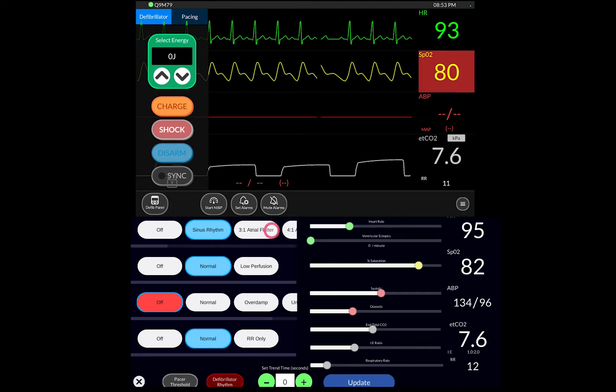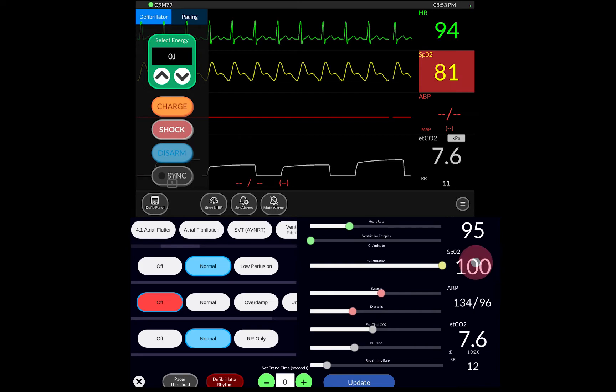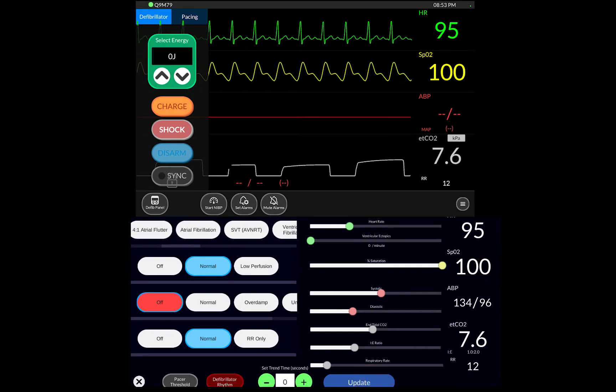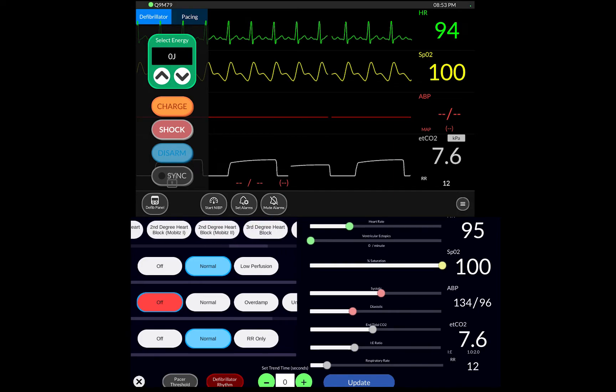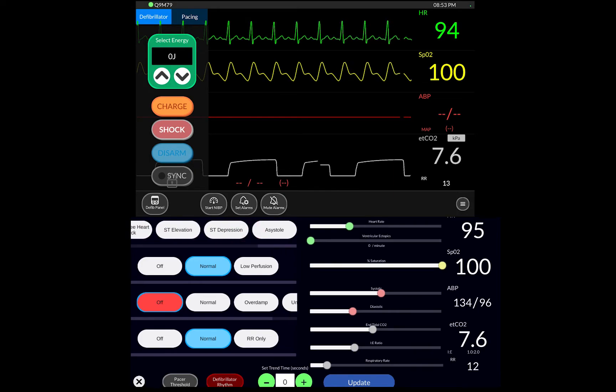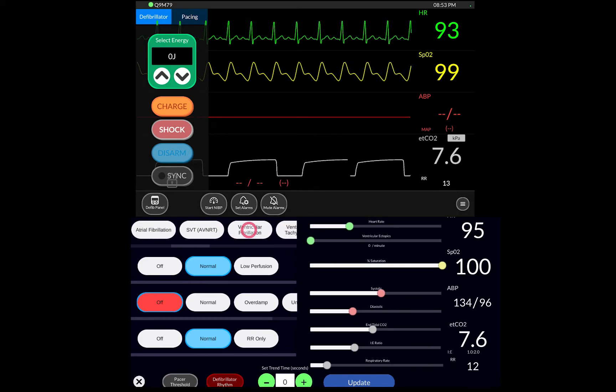Then there's obviously all these rhythms. Let me just bring this back to normal so it doesn't complain. There's all these rhythm situations. There's VF, VTAC, there's third degree heart blocks, all these things, asystole, all the things you want to do are all there.